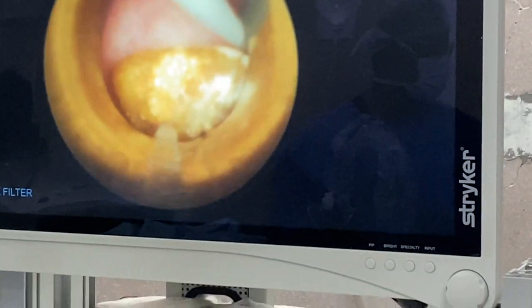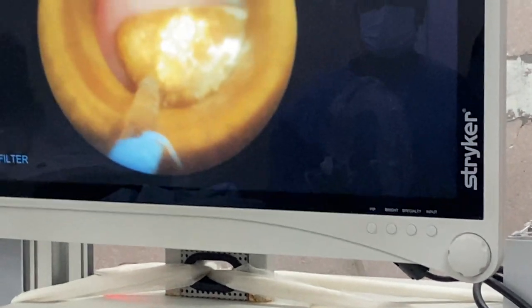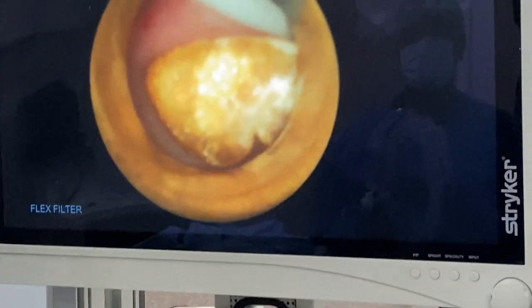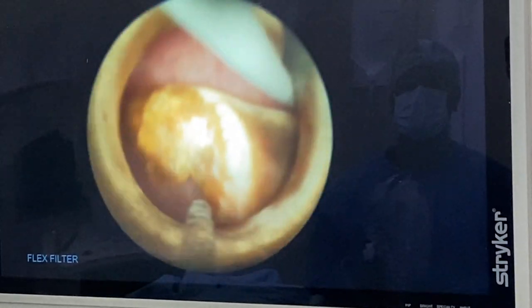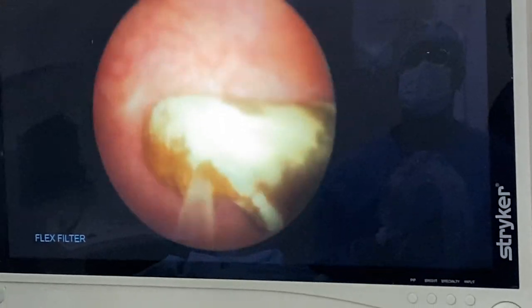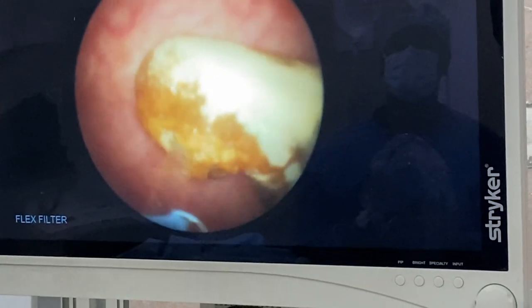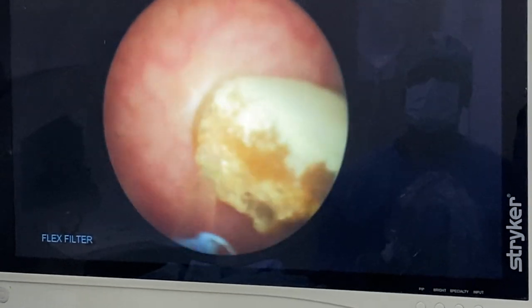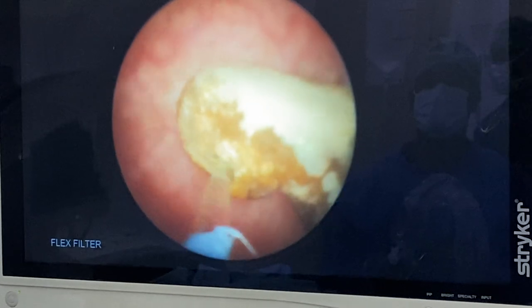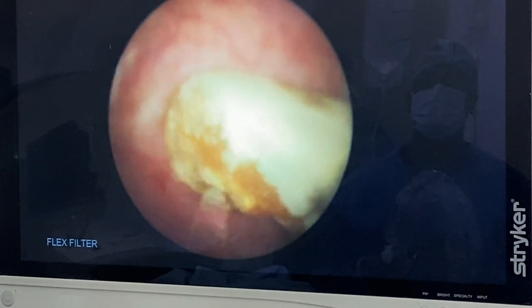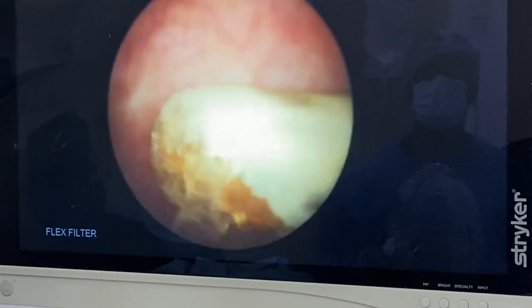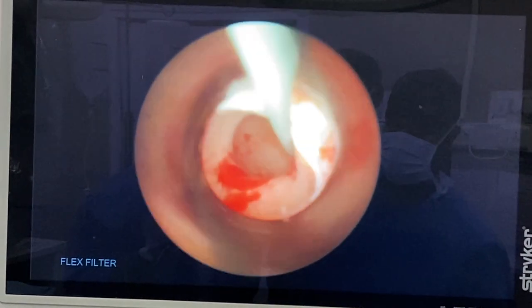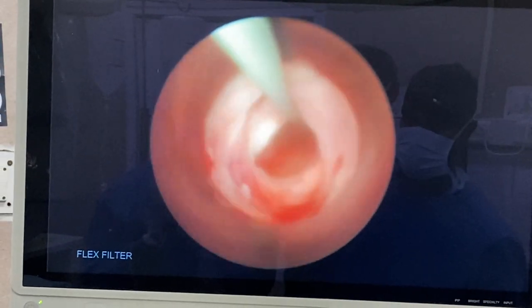We are using Holmium YAG laser in this case, with a setting of 1 Joule and 12 Hz frequency in dusting mode. The 2.3 cm stone is ablated. We took almost around 15 minutes for completely ablating the stone. This is the final endoscopy view showing complete stone clearance.